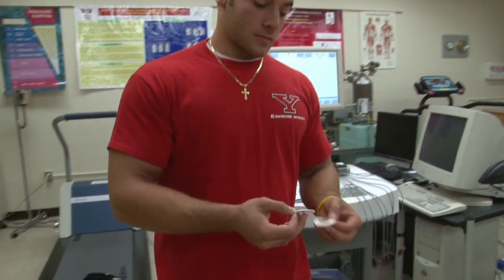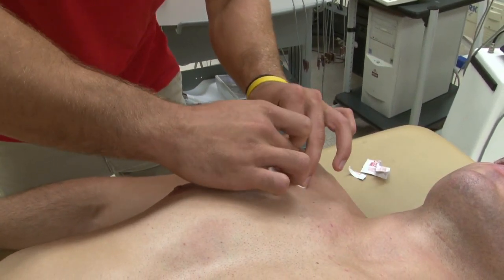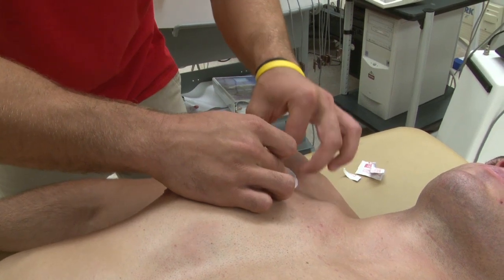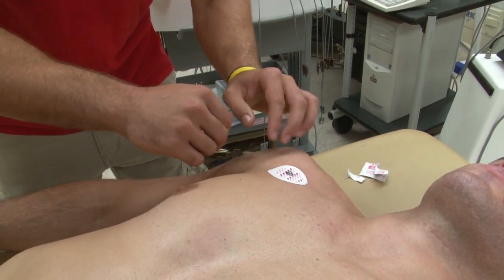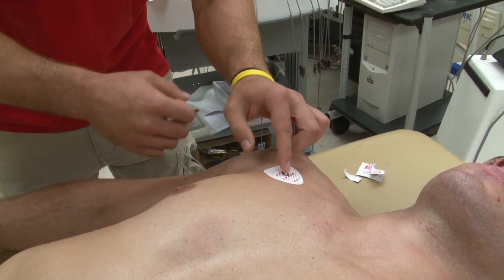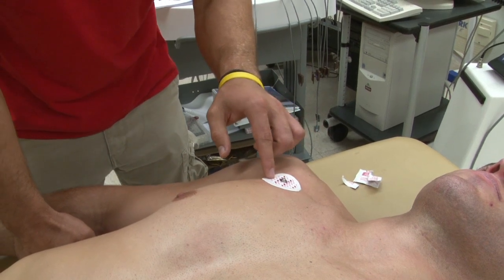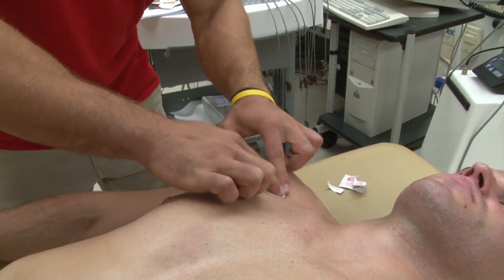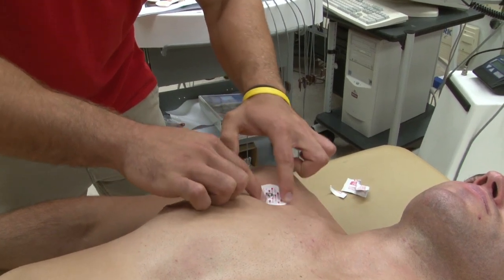So we're going to place them on the marked spots. When placing them, you don't want to put a lot of pressure right in the center. This is because there's a little gel substance in the middle, and if you press too hard, it can cause air pockets to form which can affect the ECG recording. So you just want to place it on and press all around on the outside to make sure it sticks.